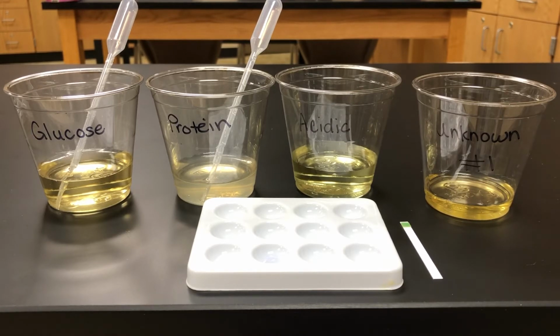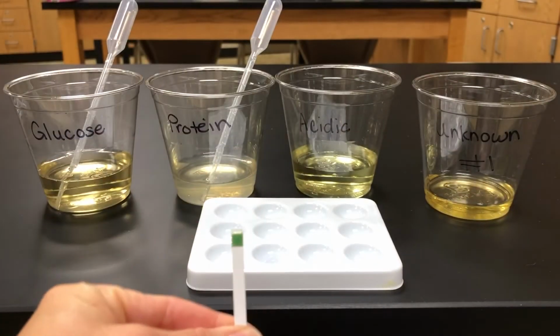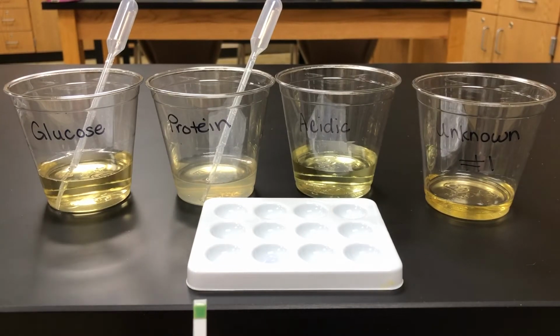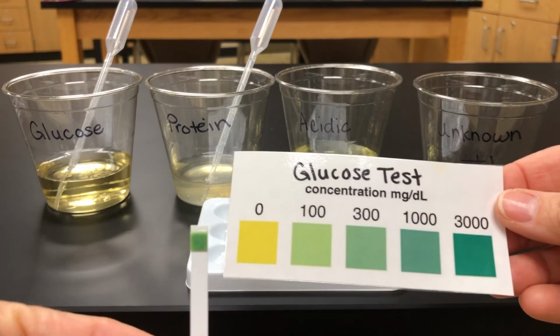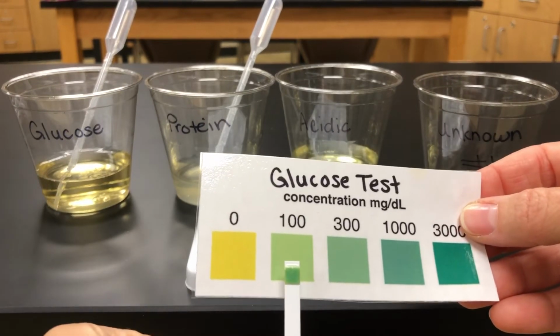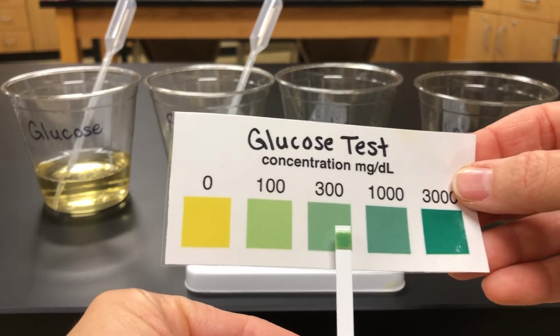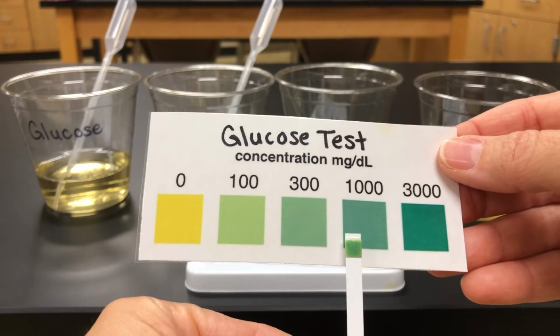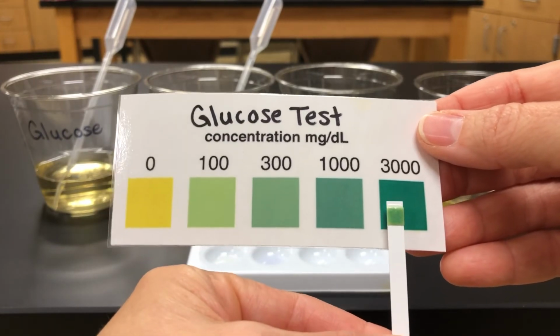Okay, guys, let's go ahead and look at this glucose. So here's our glucose test strip. We are going to compare that to this right here. Okay, so in your results table or in your results section, write down the one that you think it is. And as you can see, these are milligrams per deciliter.